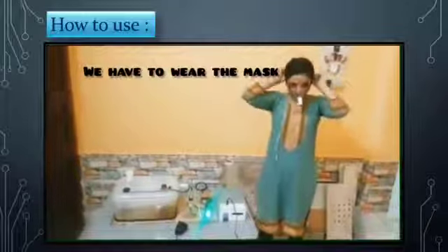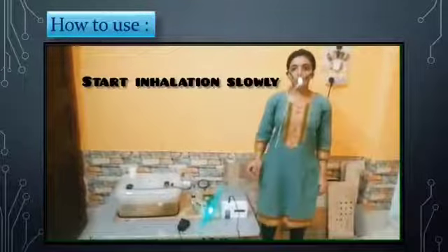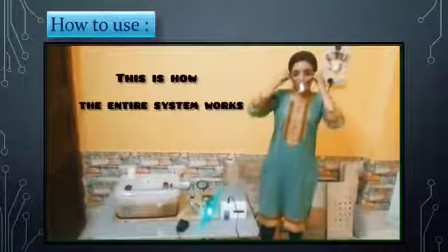We have to wear the mask and start the inhalation slowly. This is how the entire system works.